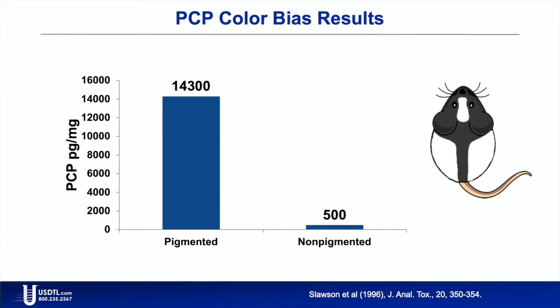It's practically impossible to come up with some sort of paradigm to say that under this situation, this kind of number represents a certain type of usage. So you've heard me say this a million times if you guys are calling in and talking to me. Anytime you're testing a reservoir matrix, or matrix where things tend to accumulate, we are not able to backtrack and determine time, dosage, and frequency. There's too many variables, and here is one of the biggest variables that you will encounter.